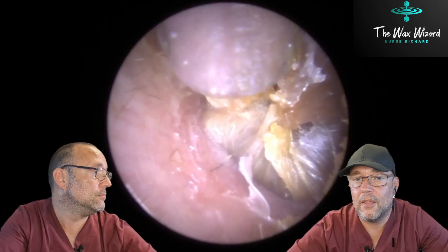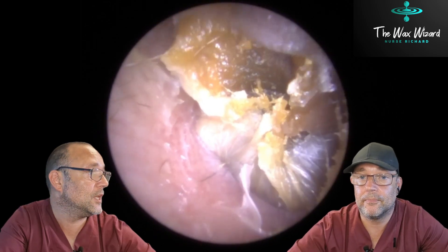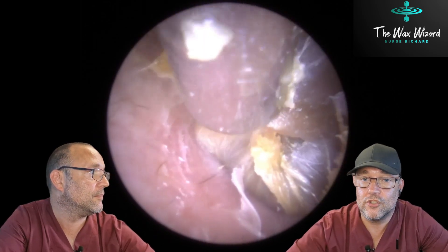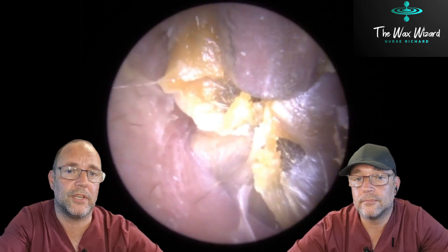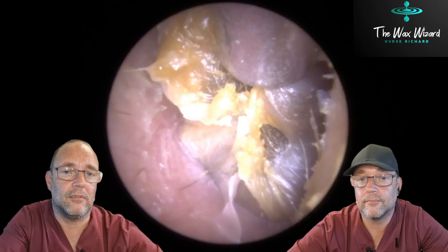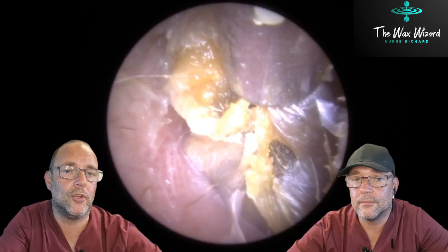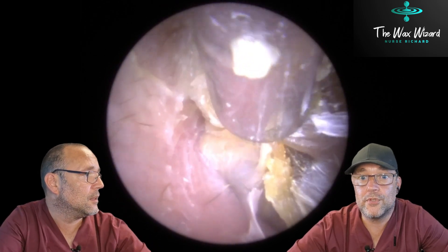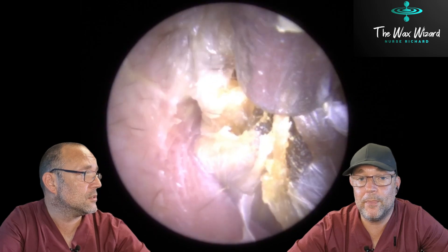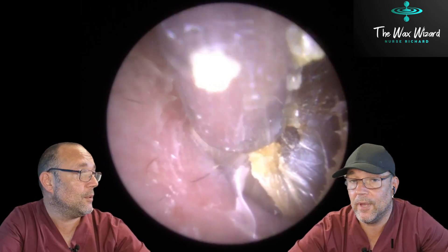So how do you think I'm doing with this one? I think you're making a bit of a meal of it, mate. Making a bit of a meal of it. So how can I make it easier? I think you should have probably put some olive oil in a bit sooner. Yeah, you're probably right. In fact, I think that's what I did. Got a bit of olive oil in and that certainly helped move things along. I probably should have done it sooner, truth be told. Yeah, you should. Anyway, where have you been this whole time? I've been doing these procedures. You've been doing the procedures? Yeah — you've been mucking about on the internet.